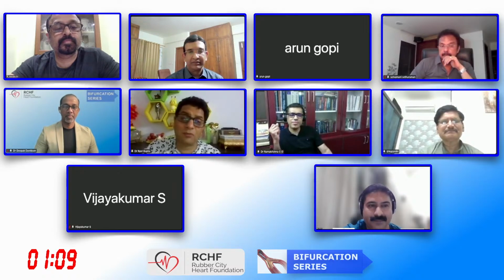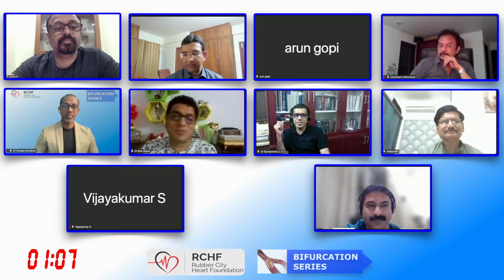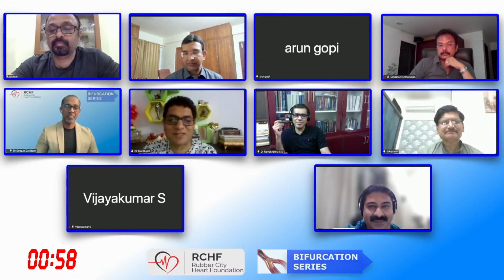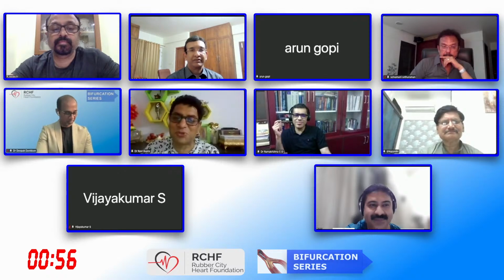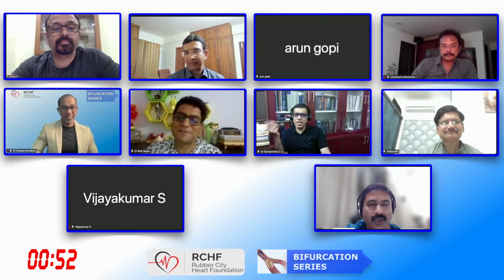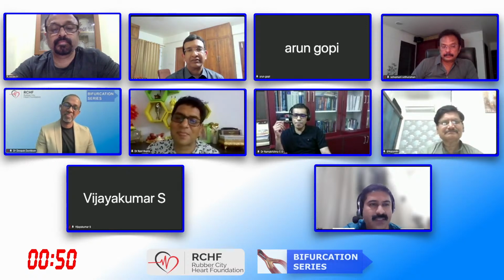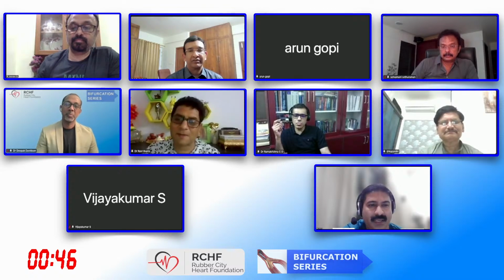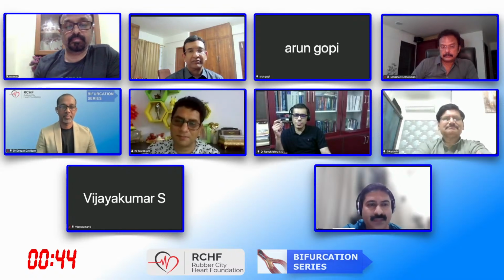I mean, we have to balance both the things. At times, we always keep on saying that better is the enemy of good in the cath lab. So whenever you try to achieve more than ideal results, then you are stuck up with something which you may repent later on. Yeah. And it was a totally occluded vessel. So once I have established antegrade flow and a non-occlusive dissection in not a major territory, I can accept it. I think all of us will accept it.